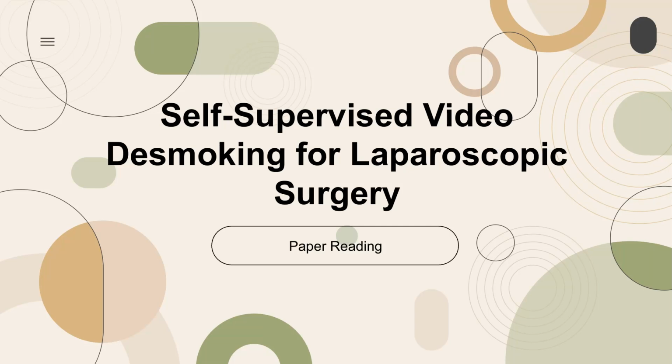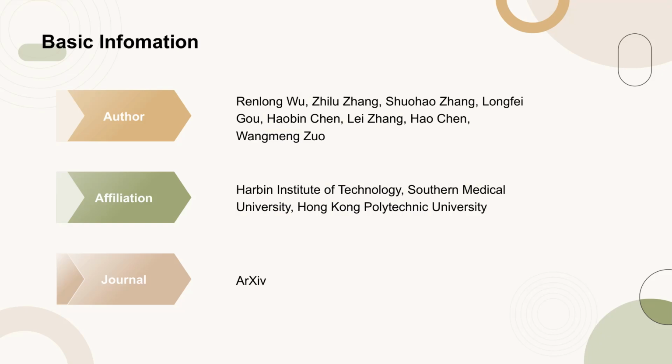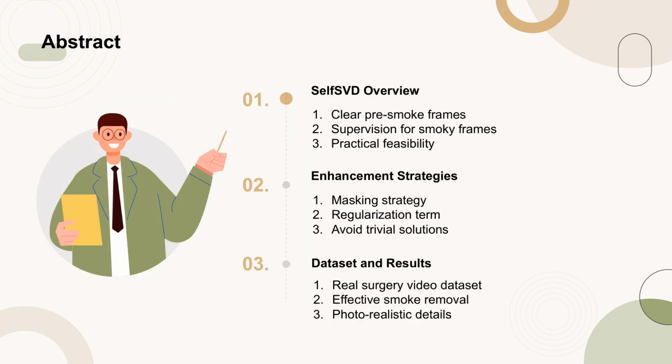Today's paper is titled, Self-Supervised Video Desmoking for Laparoscopic Surgery. This paper was published on arXiv by Renlong Wu and colleagues from Harbin Institute of Technology. The SelfSVD method leverages clear pre-smoke frames to supervise other smoky frames, making self-supervised video desmoking feasible in real-world scenarios.